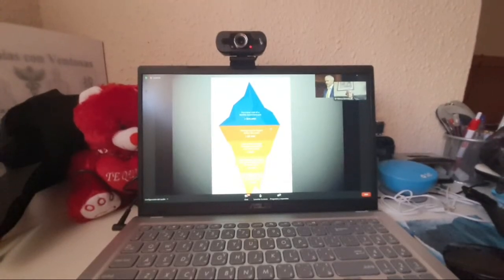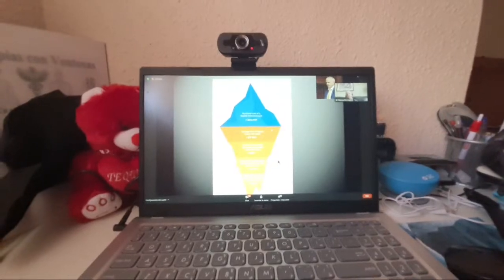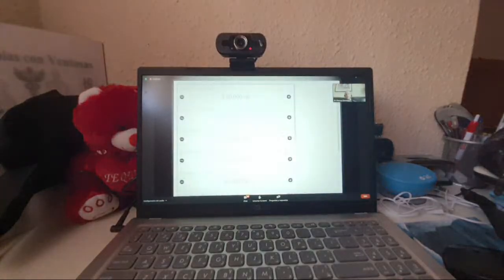Cost obviously is something that we question. So these are the visible costs related to the bronchoscope. So you've got the purchase cost of a reusable bronchoscope, but then there are other costs, the part of the iceberg you don't see. So you've got repair costs, consumable costs, time spent cleaning, and also potential cross-contamination costs.